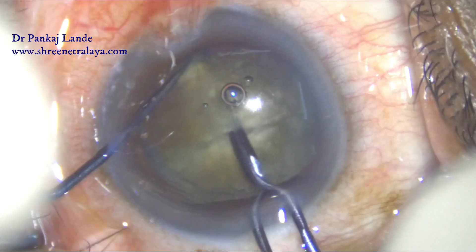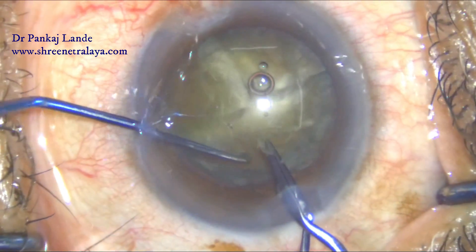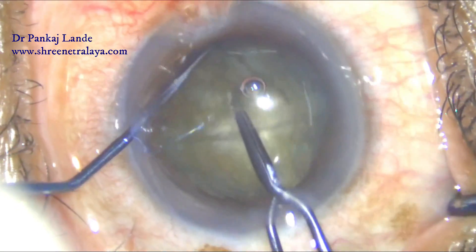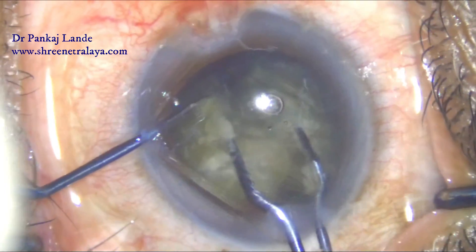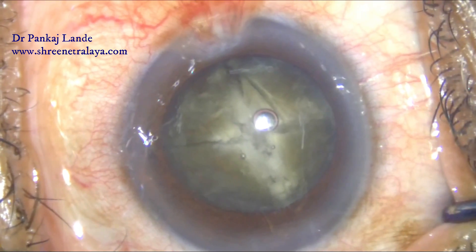I pre-chopped the remaining two pieces of nucleus into two halves each, supporting with the left hand. A proper depth of insertion of the pre-chopper is essential for successfully dividing the nucleus.